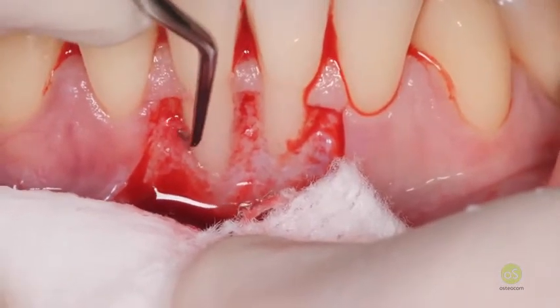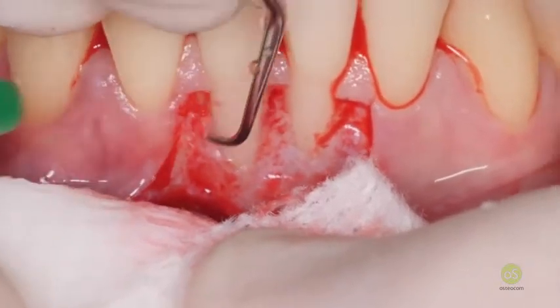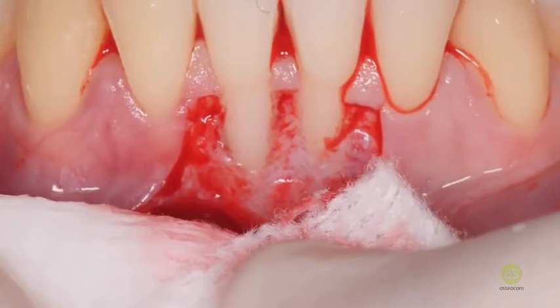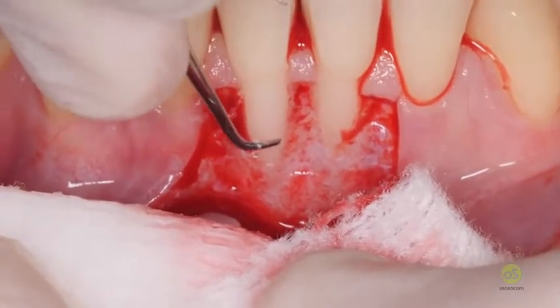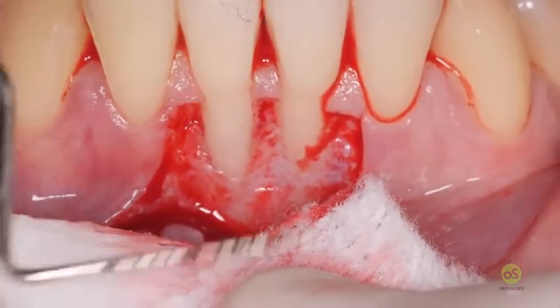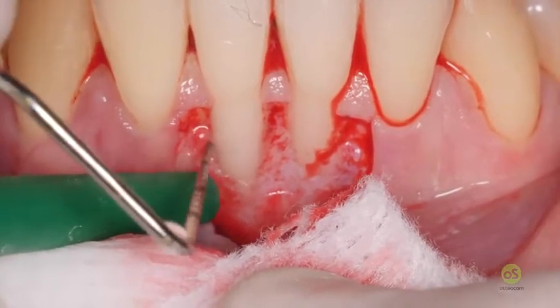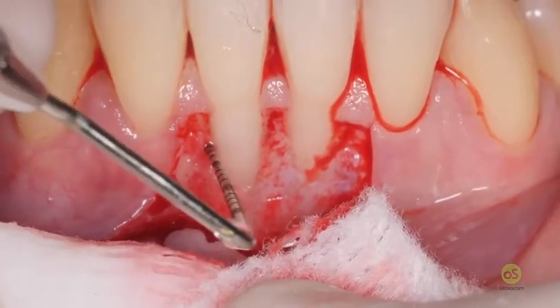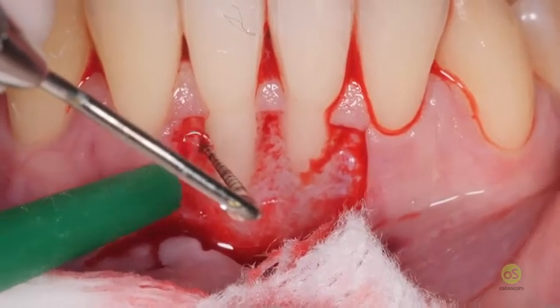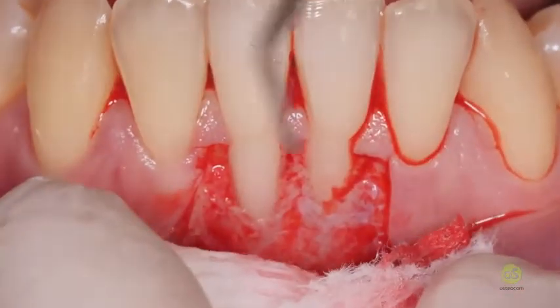You can see here, there is also a minimum amount of buccal bone loss in buccal lingual dimension, which is quite frequent in the presence of such a buccally displaced root. You see here, the bone is quite good. Here there is some minor bone loss. Now we make root planing on the second root.